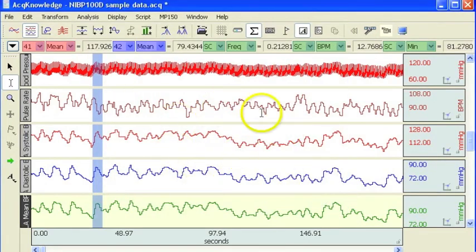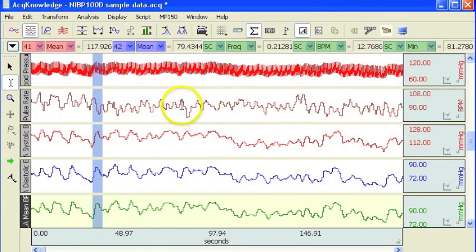So that concludes our demonstration of the AcKnowledge Epoch Analysis routine.